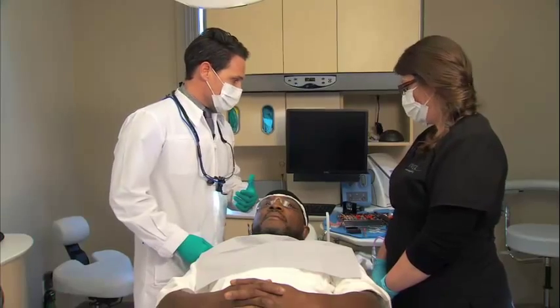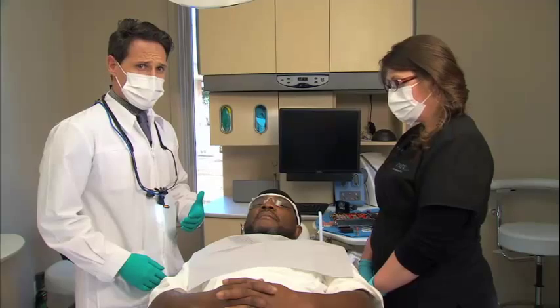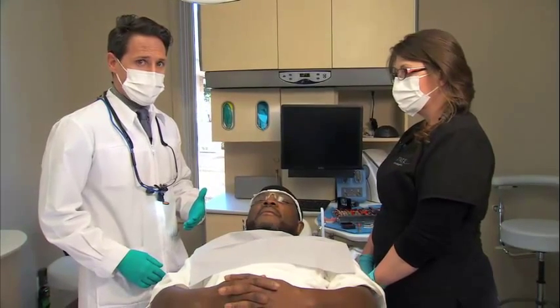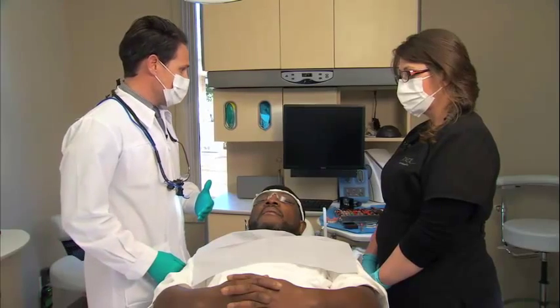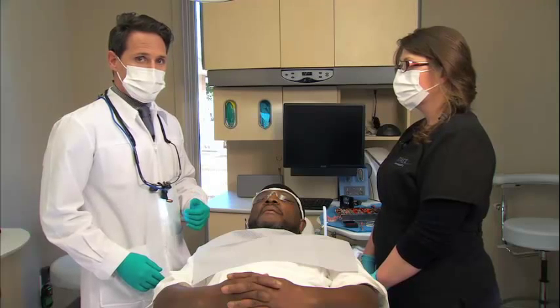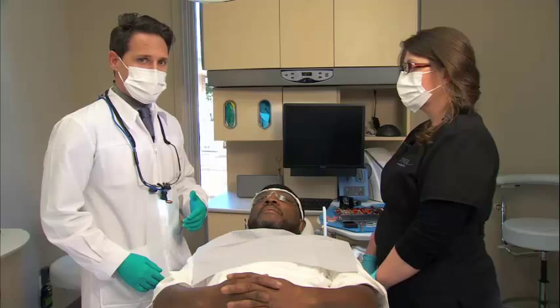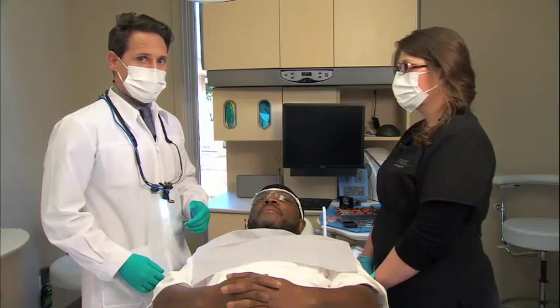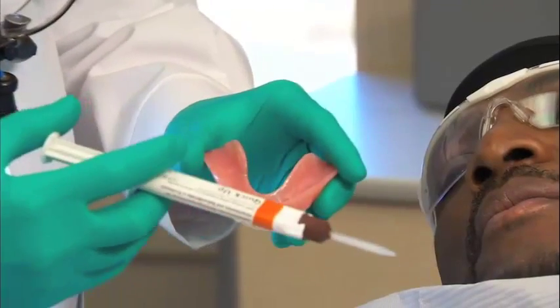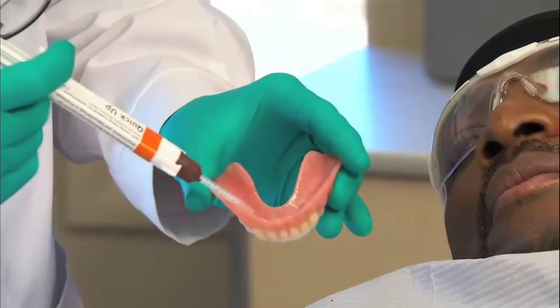We don't have a higher risk of the denture being locked on because of the method the QuickUp self-curing composite is used. We're actually only going to fill up the reservoirs about two-thirds full and have Byron bite on that with gentle force at about fifty percent. That's going to set in two and a half minutes, so it's definitely a very fast material. As with the Fit Test CNB, we just want to fill this up about two-thirds full.